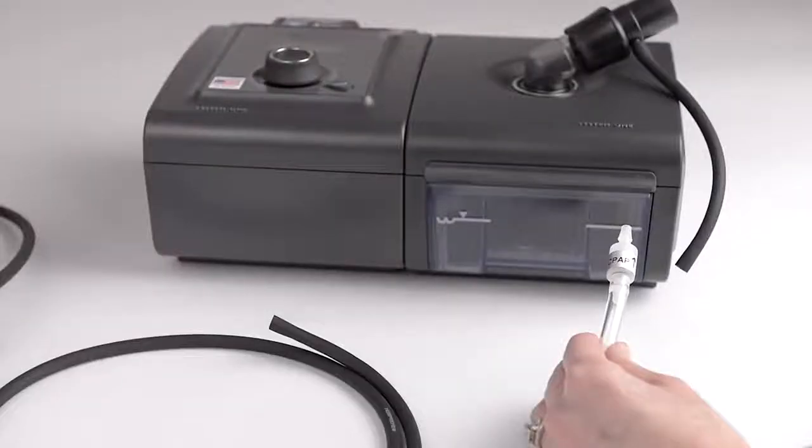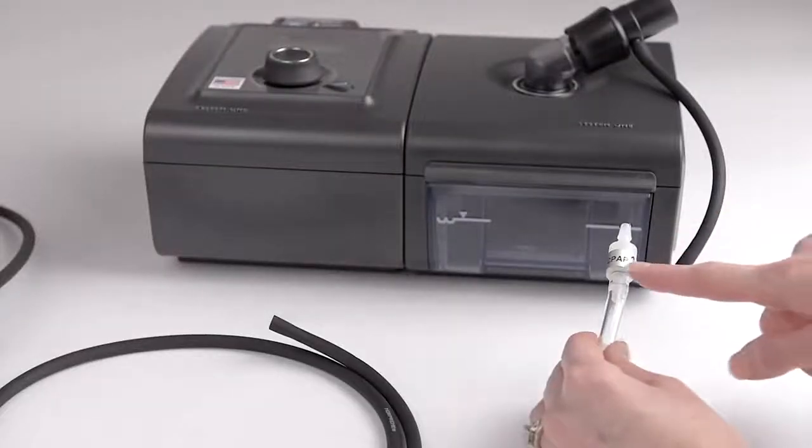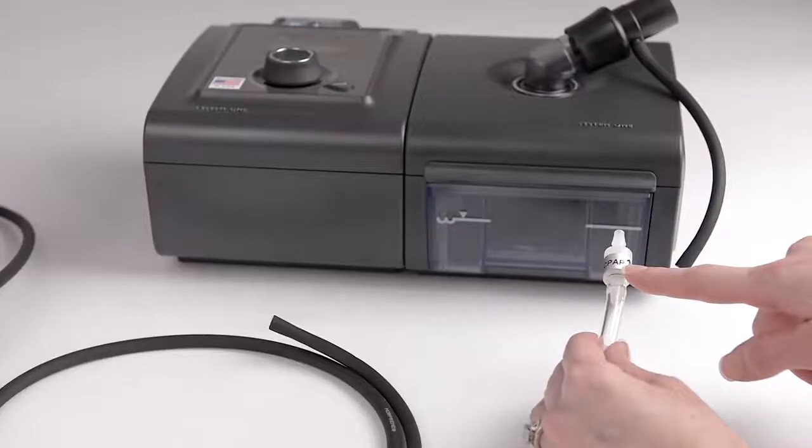The direction of your new check valve is critical. Your SoClean will not work if it is installed facing the wrong direction. The end of your new check valve has a label with two arrows that should be pointing toward your CPAP machine.